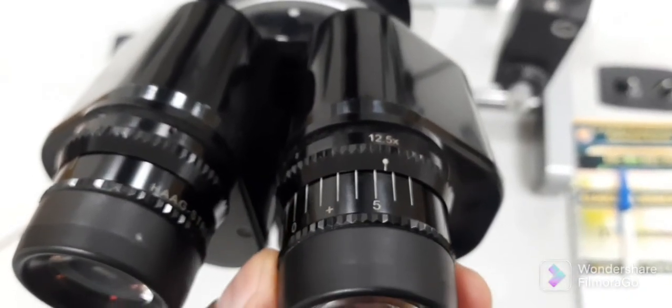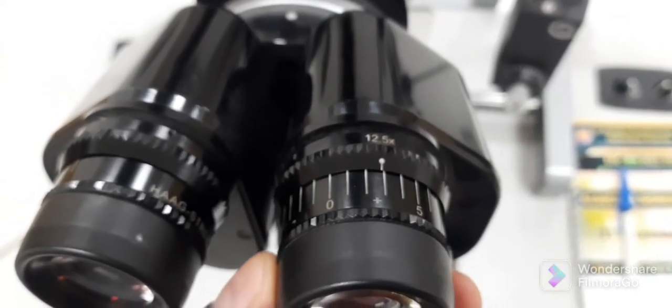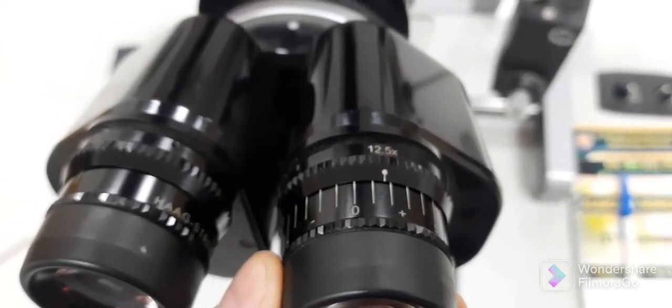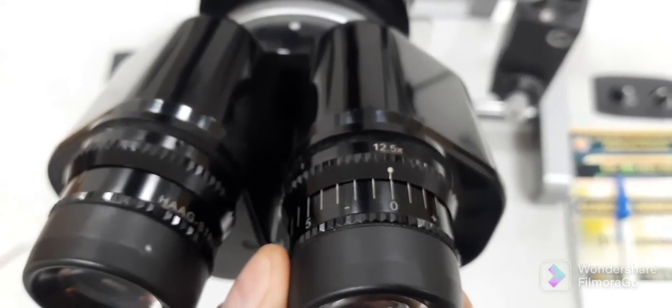Then rotate the knob of eyepiece until the text gets focused. Suppose our examiner is emmetropic, then it will focus on the zero mark. So the target text through the eyepiece gets focused as we rotate the eyepiece knob towards the zero, because our examiner is emmetropic, so it gets crisp and clear towards the zero mark which is the final position.